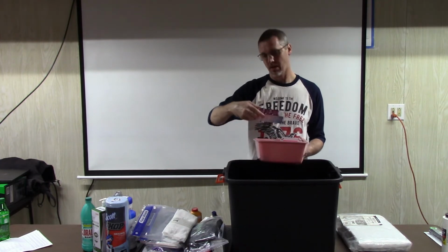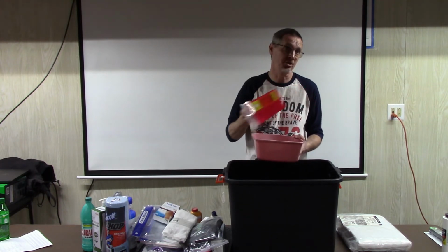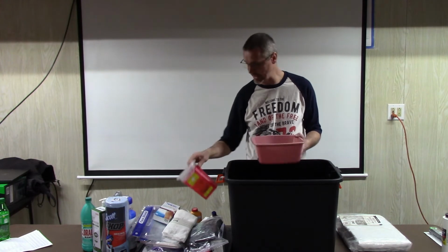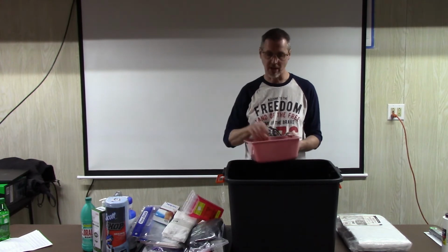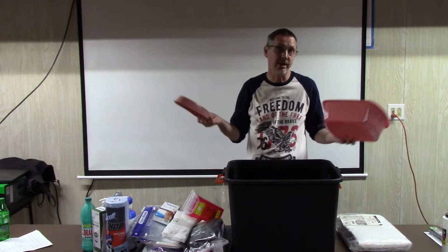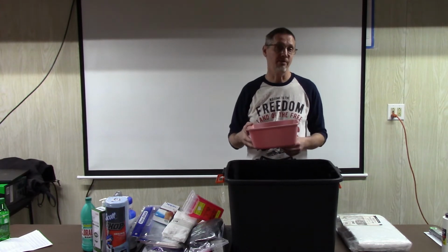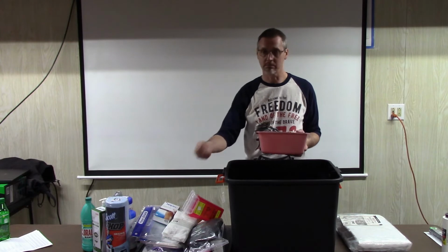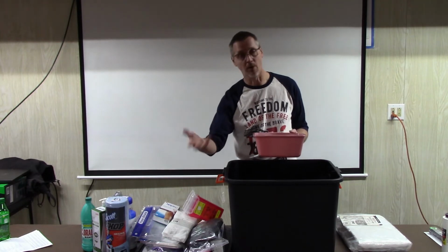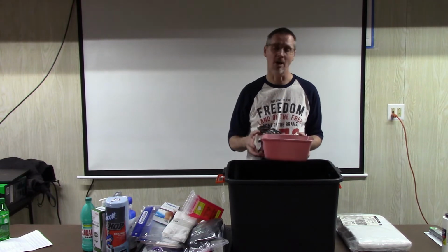Some steri strips. A sharps container, because if you end up using the scalpels, you've got to put them someplace. So we got a sharps container, and this came as a kit with the throw-up tray and the tray. So you ought to need them both. We're probably going to pick up a few more of these. These would be great if you've got 4-inch gauze that is blood soaked. You can just throw them in here to help clean up.